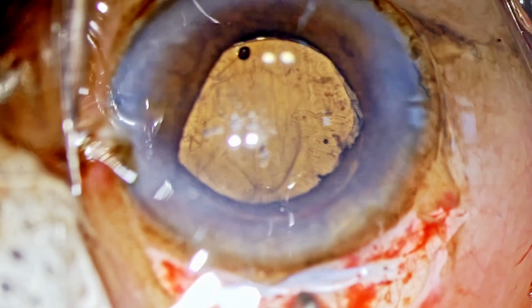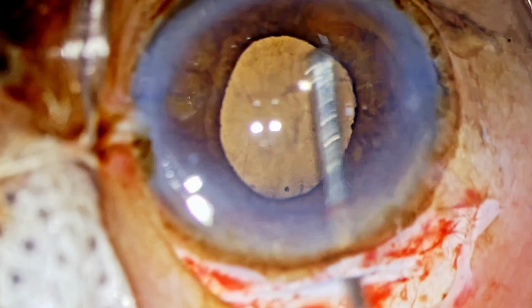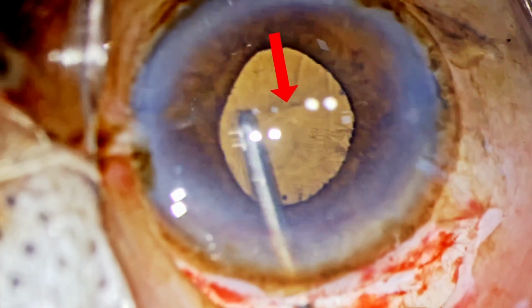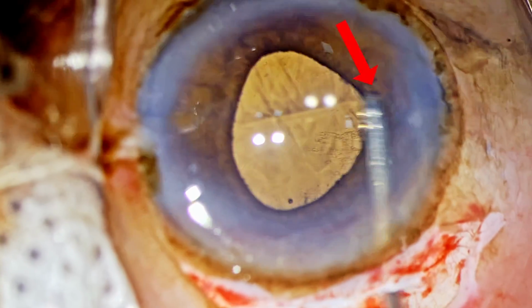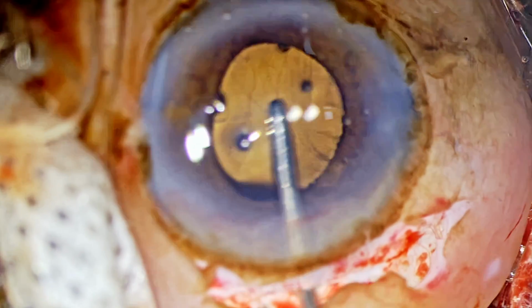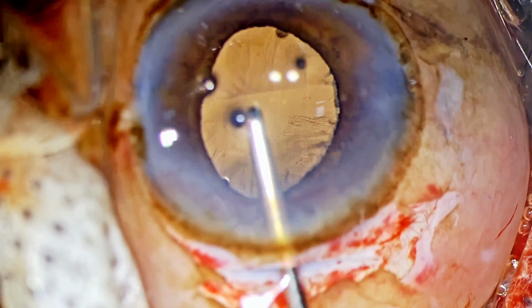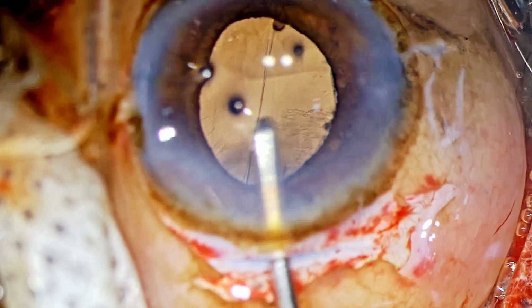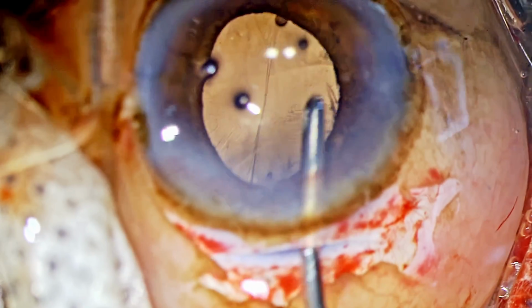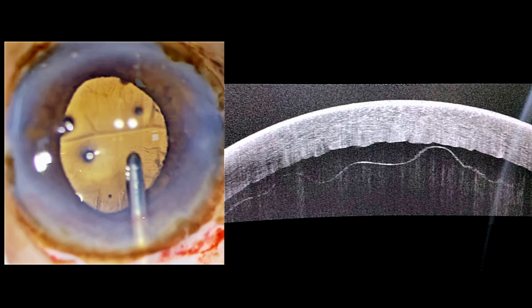After putting in the intraocular lens, when the surgeon is trying to irrigate out all the OVD, even now we can distinctly see a line starting from the left side port and extending all the way up to the right side port. And the appearance of the cornea beyond this demarcation line is slightly different. As he's trying to remove the OVD, we can see intracorneal waves going on. And this is a surefire sign that a DMD is possibly occurring. And this DMD is quite huge. It's starting from these two side ports and extending all the way up to the inferior limbus. And it is a lamellar detachment. That's what the OCT is revealing.